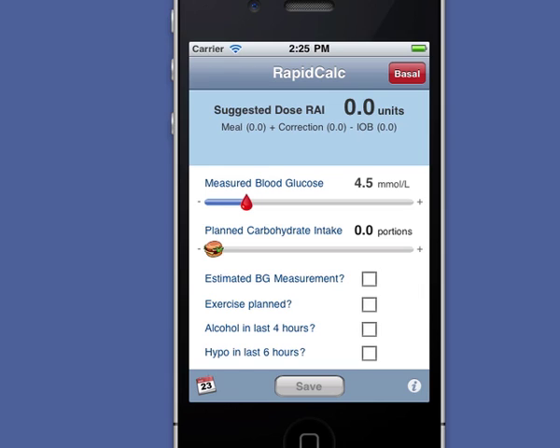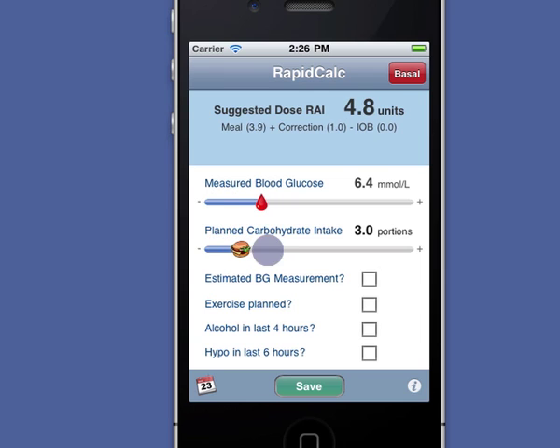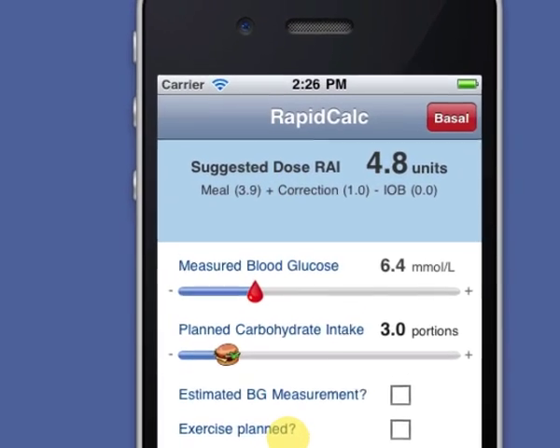RapidCalc opens at this home screen ready to calculate a bolus insulin dose. I simply enter the reading for my blood glucose meter using the slider and tap to make fine adjustments — no keyboard needed. I enter my planned carbohydrate intake and there's my suggested bolus dose.